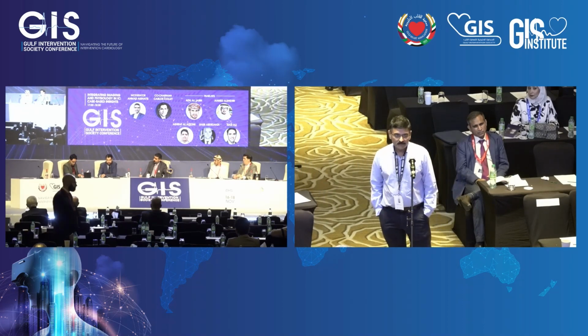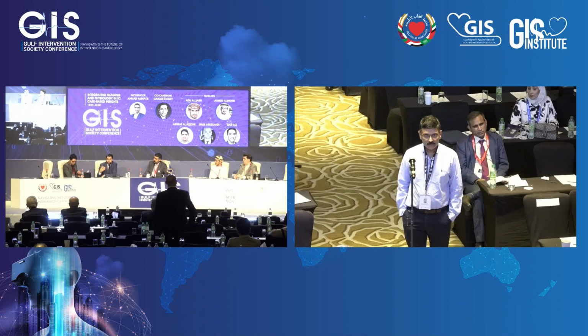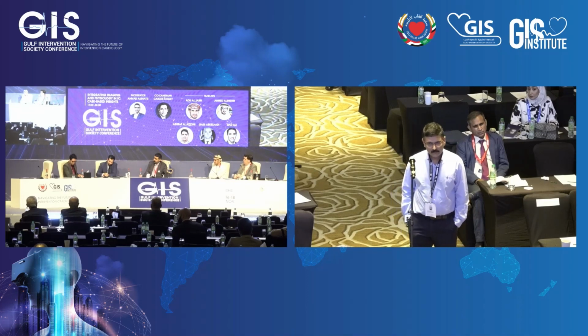That's a great comment. And I have to tell you that we analyzed the data of TARGET FFR. We did the core lab for that trial. And what I can tell you is that post-PCI FFR is just a marker of the disease that you had at baseline before you put the stent. If you have diffuse disease, you will have low post-PCI FFR. If you had focal disease, you will get high post-PCI FFR. That's what we learned from TARGET.